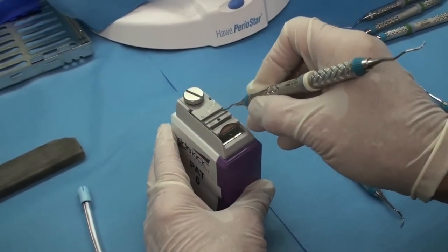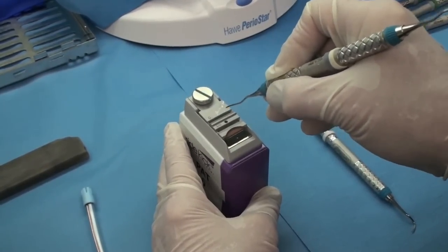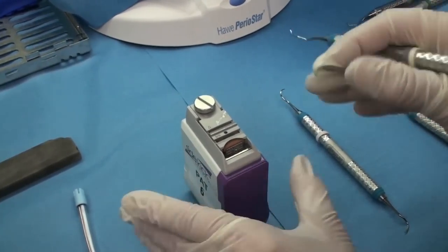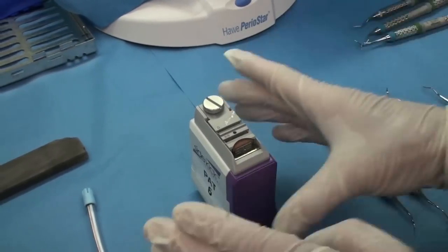And the directions that come with this though, they have you moving it back and forth. I don't like that because it jumps too much and then I feel like I'm changing the blade. Same at the Periostar. They have you moving the back part. Don't do that because then again, you're changing the angle of your blade.